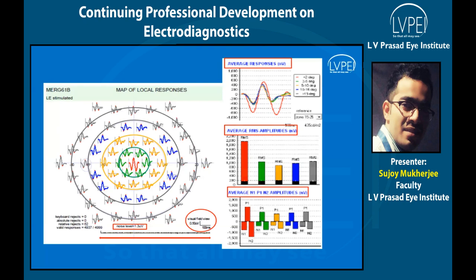Now, answering the first question, about visual acuity: there is no particular guideline that a certain visual acuity should be present. But the theory is, even though the patient has poor visual acuity or cannot see the target properly, if the patient maintains proper steadiness, we can perform the test. Ideally, if the patient cannot see, usually the patient makes a lot of eye movement. But if the patient keeps steady properly, then we can also run the test.